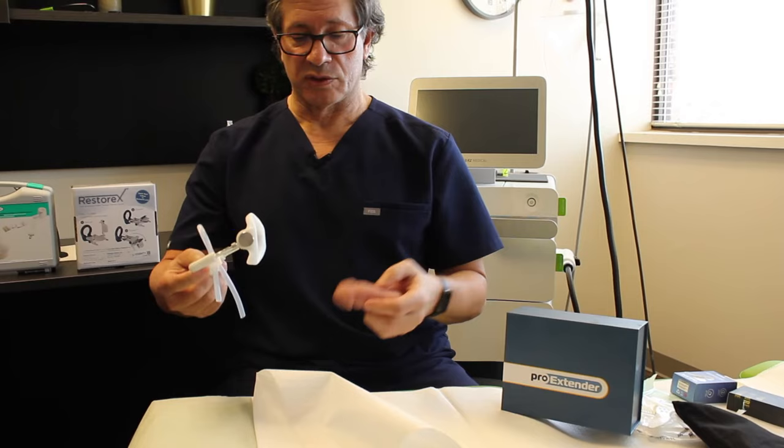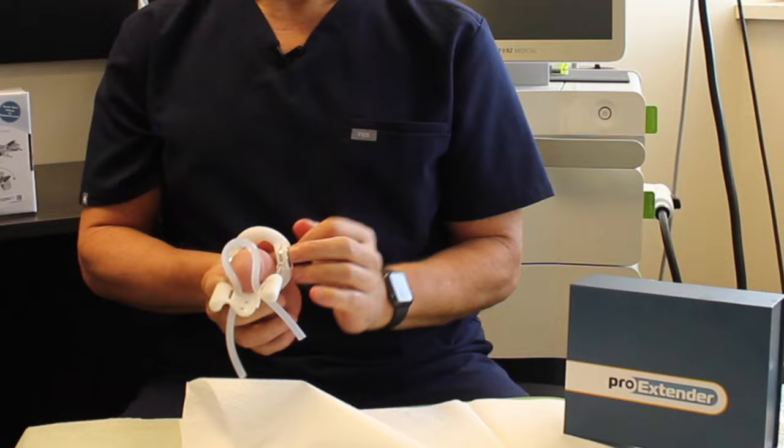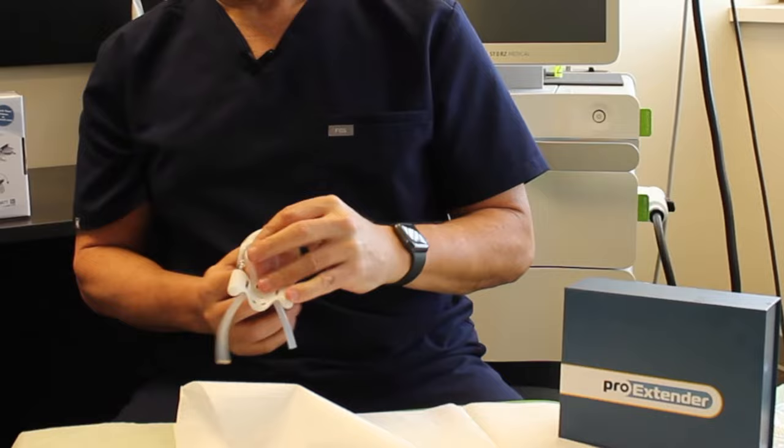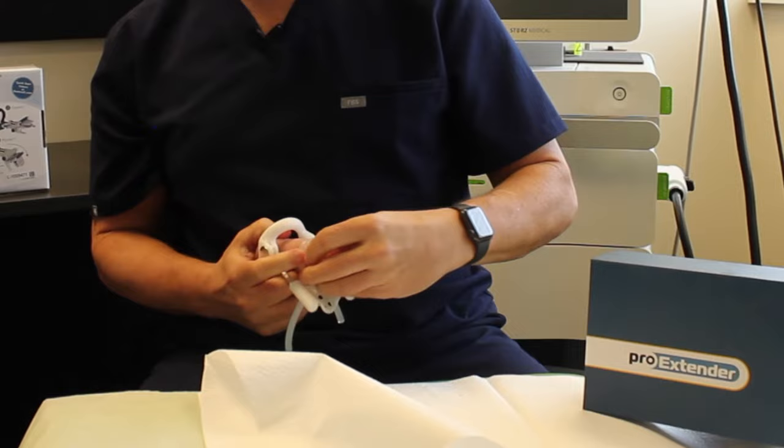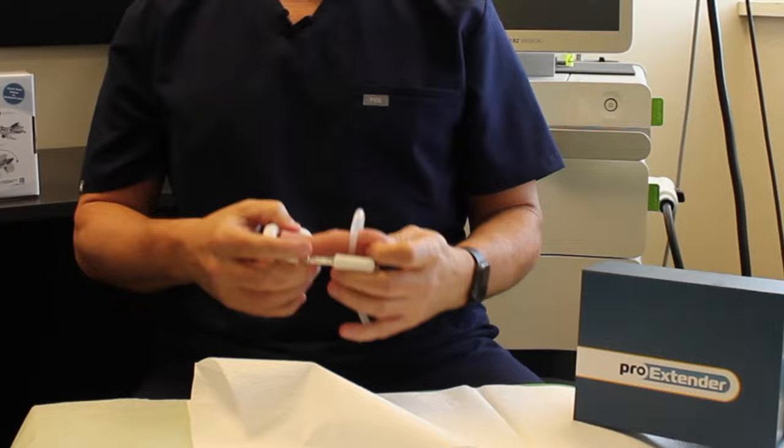You slip your penis through this hole here, pressed up against your body. Your penis is then slipped through this silicone strap here. You then tighten it up and allow your penis to extend.